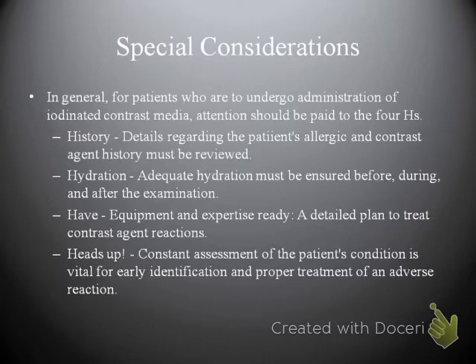The second H is hydration. Adequate hydration must be ensured before, during, and after the examination. One of the things that can decrease renal function is dehydration, and so it's essential that the patient be hydrated. The third H is have, and this pertains to equipment and expertise ready. A detailed plan to treat contrast agent reactions should be in place. So there has to be a protocol in place in case a patient does have an allergic reaction to the contrast medium.